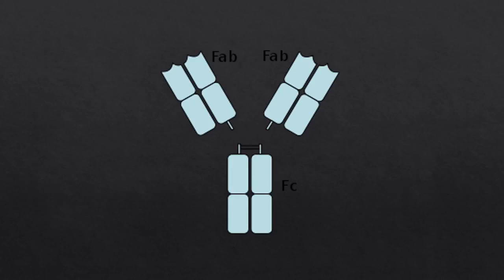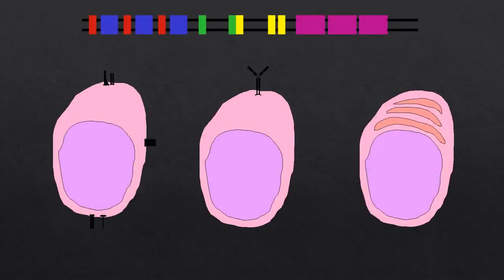The electrostatic interactions between the antibodies and their FAB region and the epitope on the antigen results in specificity that enables IHC in the first place. Furthermore, the FC region, which is comprised of the heavy chain of the antibody, is a protein that can be targeted by secondary antibodies. The fact that antibodies are specific to a given epitope is the result of the mechanism of the immune system itself.